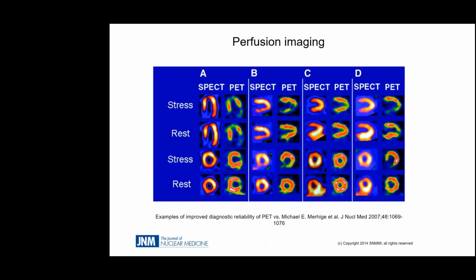And this is an application on the heart. The great thing about these modalities is that, depending on the tracer, we can follow the tracer, and these tracers can be designed and manufactured to participate in some part of the metabolism of the person. So they can give us a purely functional snapshot of what is going on in the heart.